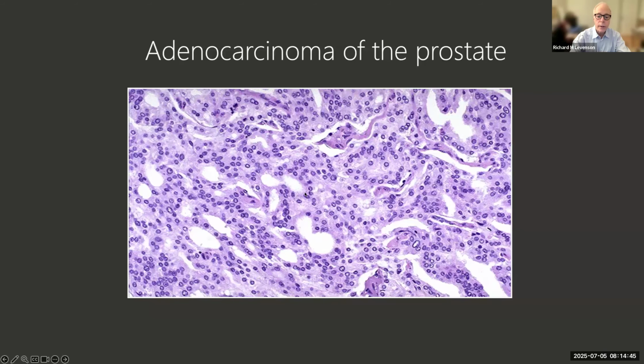Again, if we look closely, the nuclei look fine. They're little and round and more or less the same size. But if you check, there's really no structure that makes any sense. It's just a fairly uncontrolled growth of cells. This is cancer. It's not doing any good for the patient, and if not treated, may go on to metastasize to the brain or the bone or other tissues, liver, and kill the patient in a few years or decades.